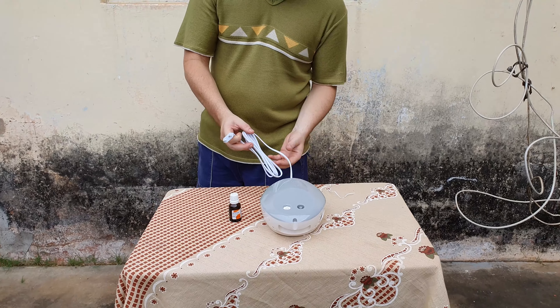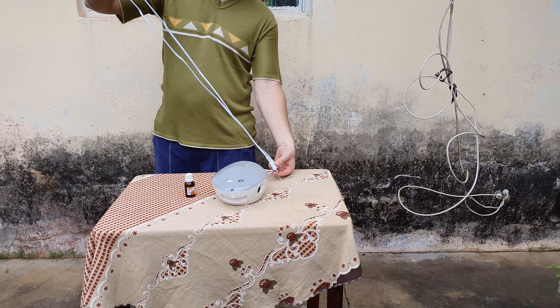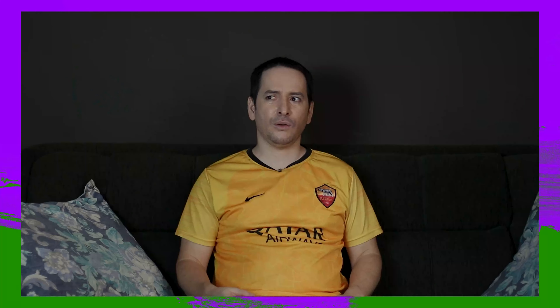Agora tem dois detalhes que eu queria mostrar para vocês, que muita gente não mostra nem em review. O primeiro é o tamanho do fio: ele é bem grande, bem extenso, tem aproximadamente 2 metros. Então você pode ficar bem tranquilo, deitado na cama para utilizá-lo. A única coisa que eu não gostei desse aparelho é que a tomada não veio com fio terra. Eu gosto muito do fio terra porque a energia do país é muito irregular, e o fio terra garante mais estabilidade para os equipamentos elétricos.